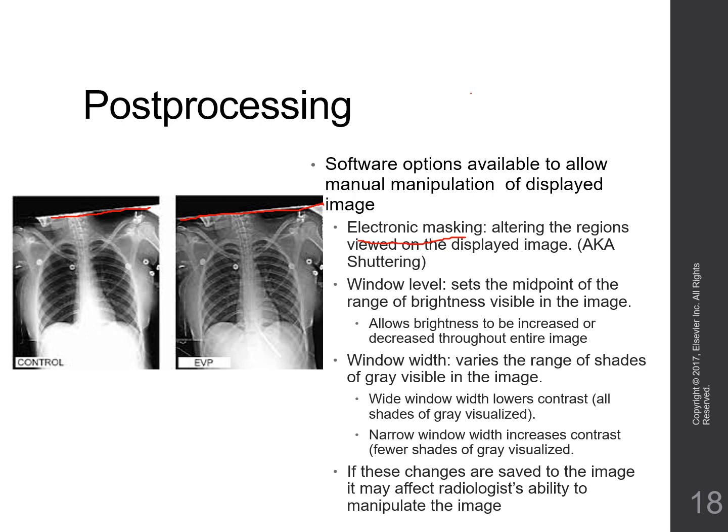Now, anytime we add masking, windowing, or leveling, save that change and send it through to our radiologist. It resets, it moves us from the raw data to the new settings, and it will really limit the physician's ability to control or manipulate some of those changes.